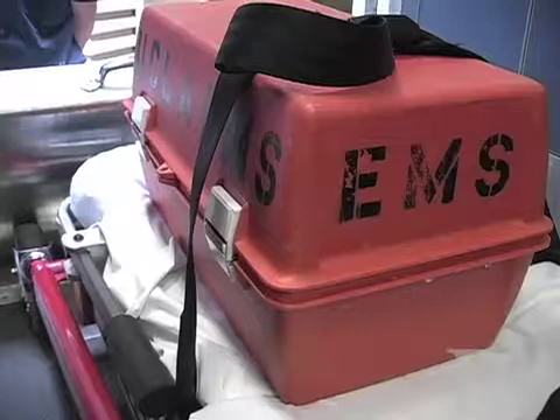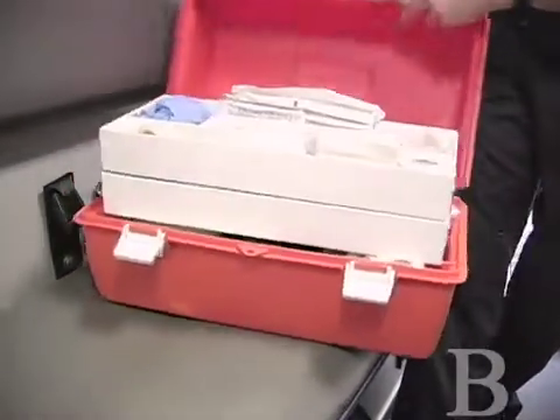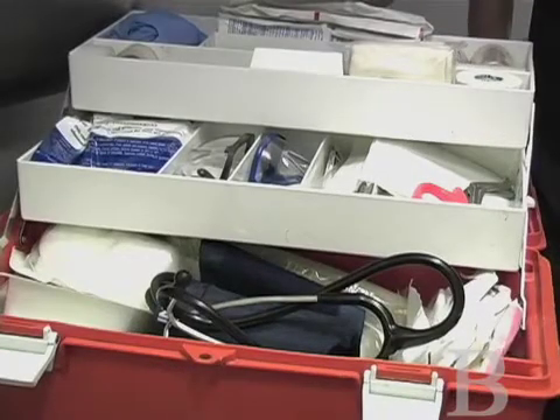Finally, at the end, we have our trauma box. The trauma box is kind of everything else that we need, and pretty much with this, we could stop any type of bleed that was needed.